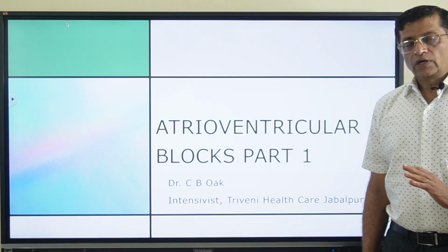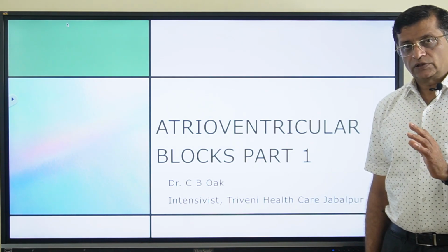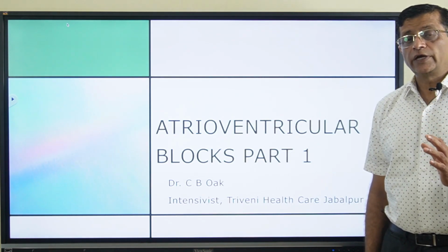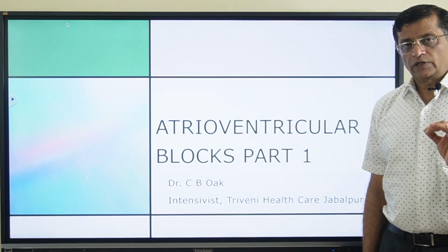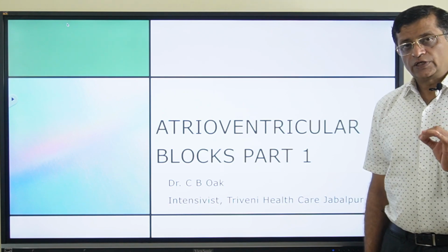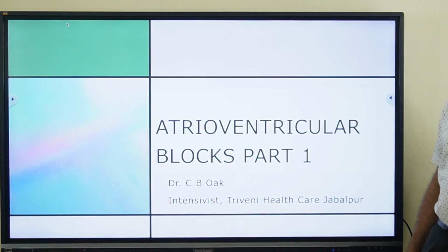In this tutorial we will discuss the different definitions of AV blocks, number 2 the etiology of AV blocks in general, and then we'll talk specifically about first degree AV block. So let's start. AV blocks part 1.